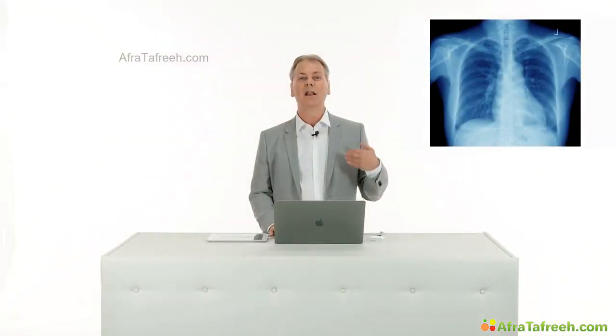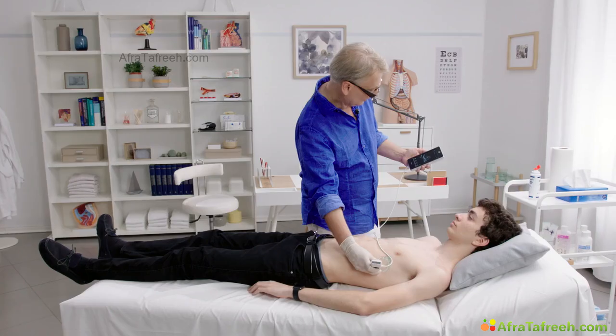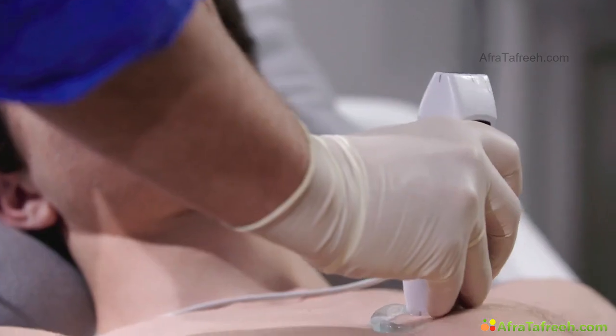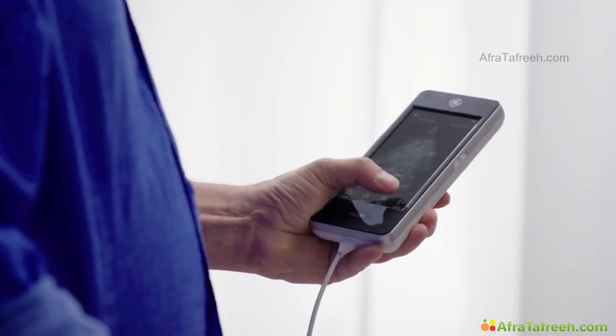In the following lecture, Professor Thomas Binder from the Medical University of Vienna, Department of Cardiology, will show you how to image the lungs and how to detect pleural effusions.